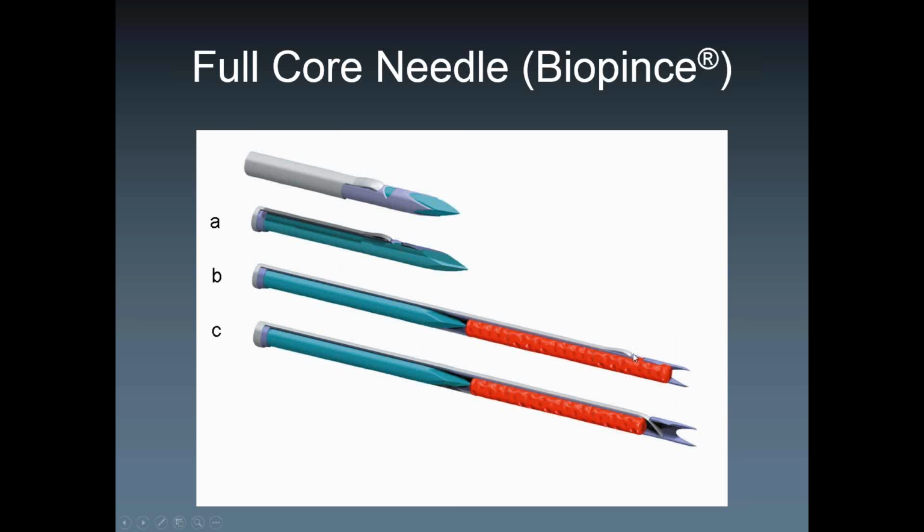However, this device portion here is very flimsy. And often enough, you will have a dry sample because this kind of blade will not run into this little notch here. That happens when the introducer is dry. Once the introducer is in the target and you remove the inner stylet, the moment you remove it, you're going to suck up blood into the introducer, which is your lubricant, which is what you want. So in that case, it mostly works out okay.